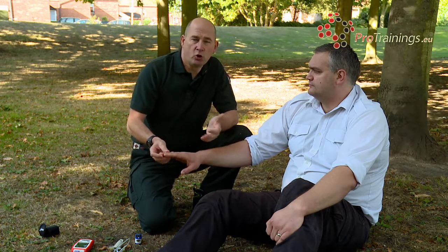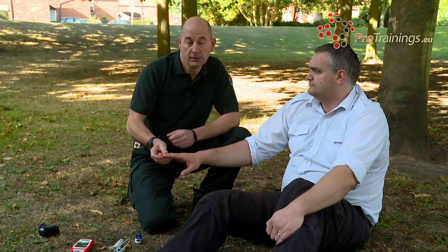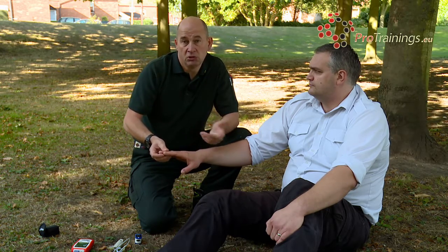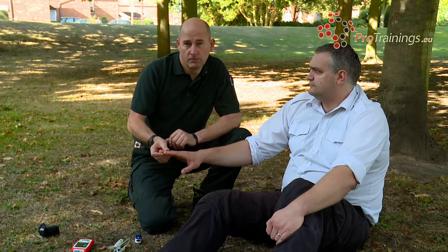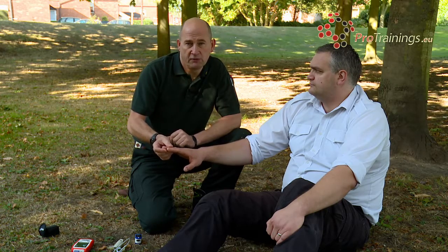And also things like tight clothing, posture, oxygen levels in the room that they're actually breathing, carbon monoxide, those sort of things will all give you potential false readings or fake readings on a pulse oximeter. And we need to have an accurate reading. Non-accurate readings aren't worth taking at all. So first of all, we find a finger, we make sure there is no restriction to the arm at all, not affecting the blood flow to that finger itself.